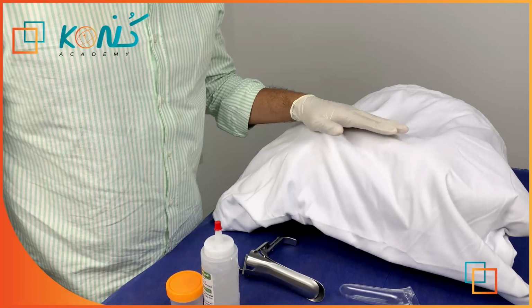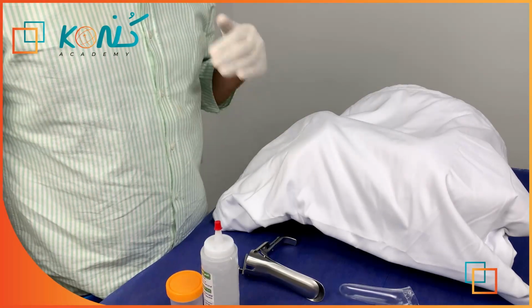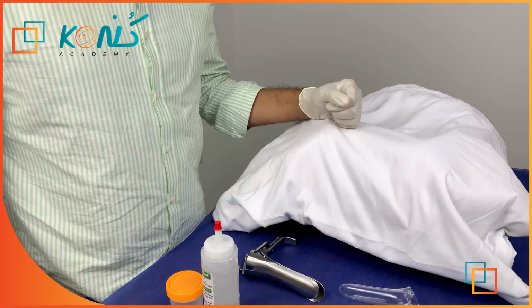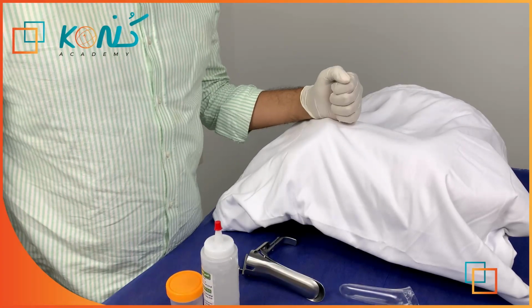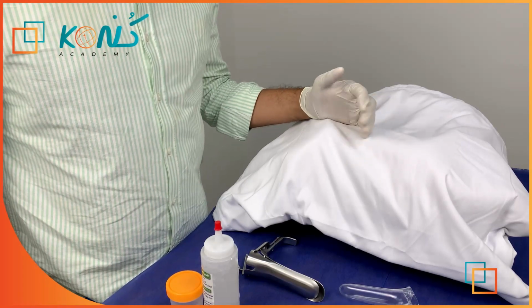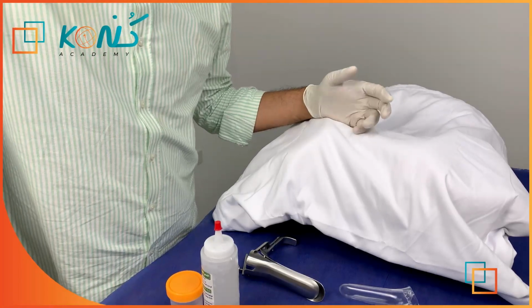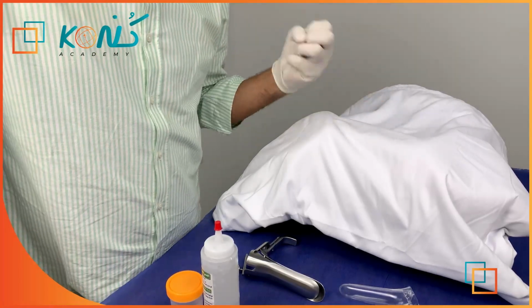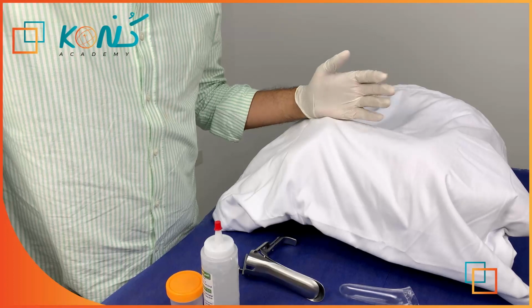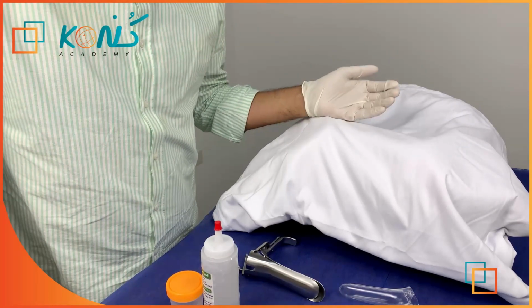We will talk about the steps of speculum examination and cervical smear. But before moving to these steps, some points to keep in mind. Firstly, the ideal position for you is that you should have a chair and sit on this chair. You should also have a good light source. And I told you, if you wish, you can advise your patient to empty her bladder.